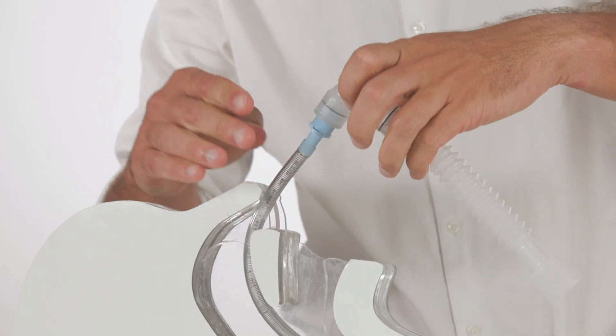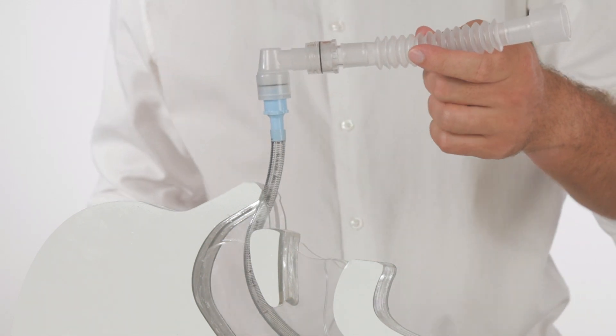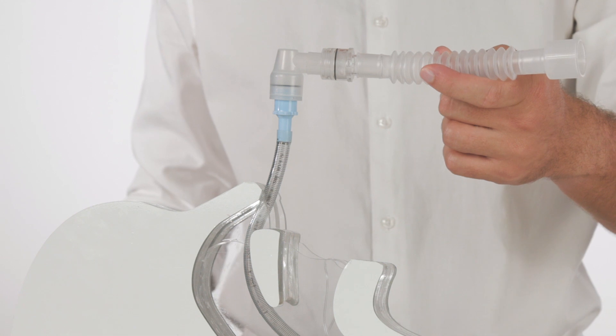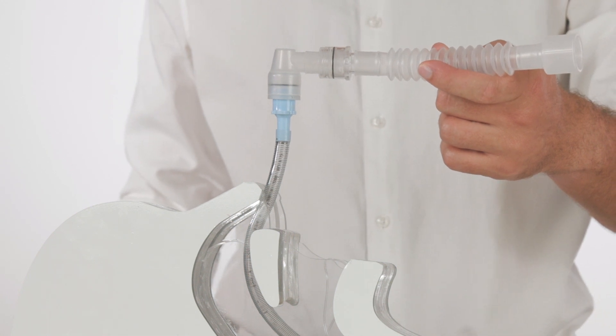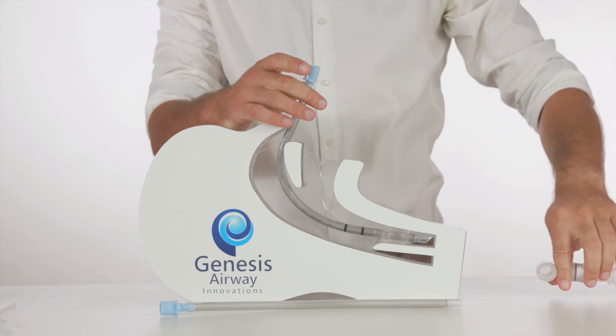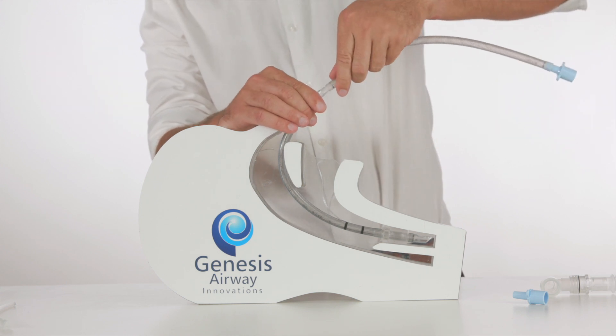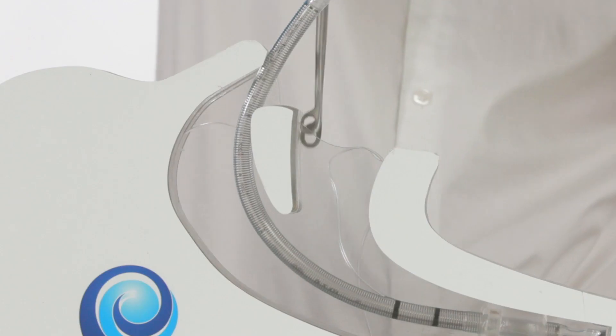There we have the modified retrograde nasal endotracheal intubation technique with minimal interruption to ventilation. To reverse the procedure, the 15mm connector is removed and the extension tubing is reconnected to the endotracheal tube with a twisting motion.